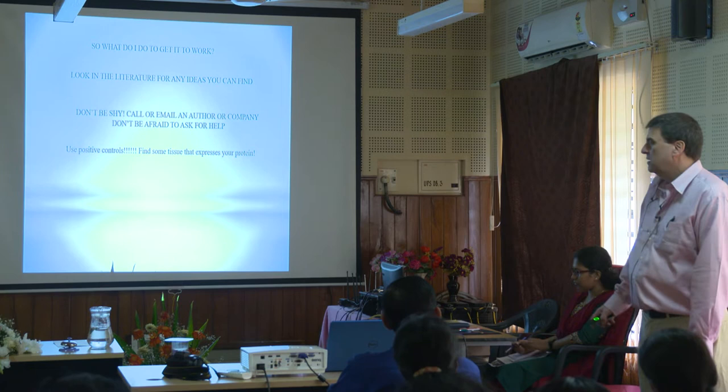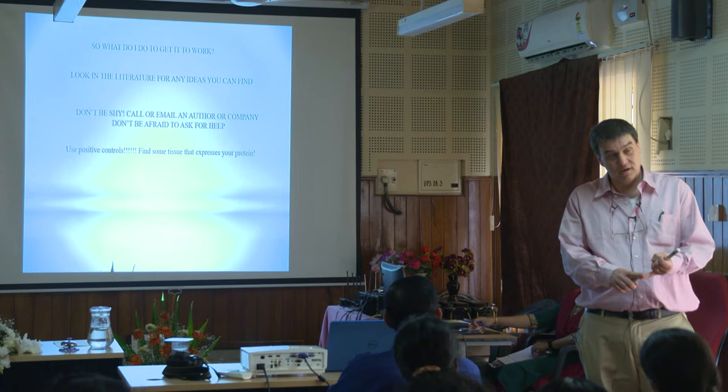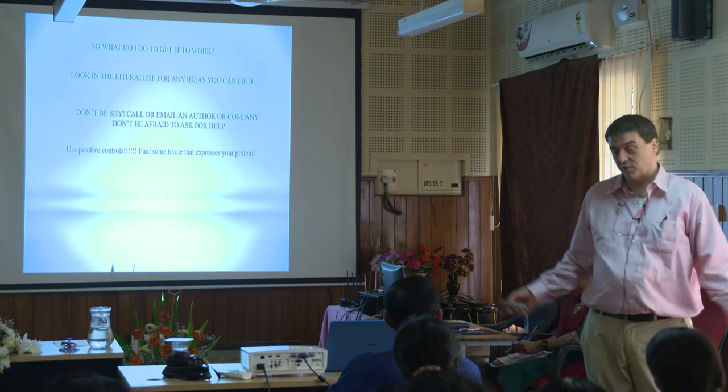Well, so they did the staining, and it didn't work. Did the staining not work because it didn't work? Or did the staining not work because the protein's not there? It's super hard to interpret something like that. So in that case, we definitely need some kind of positive control.